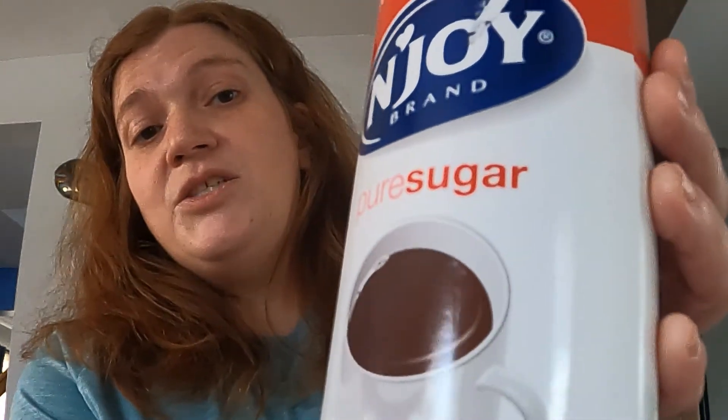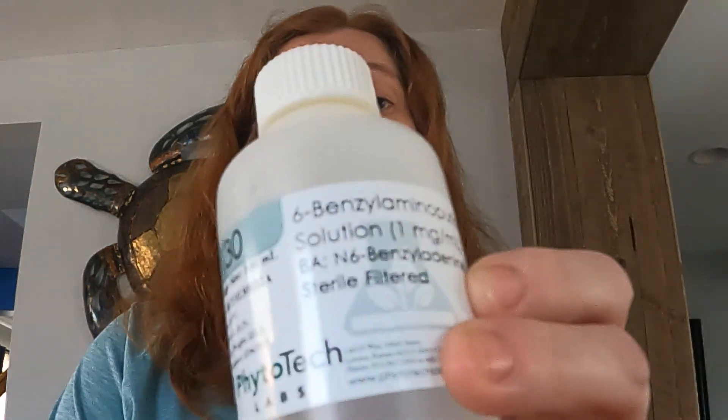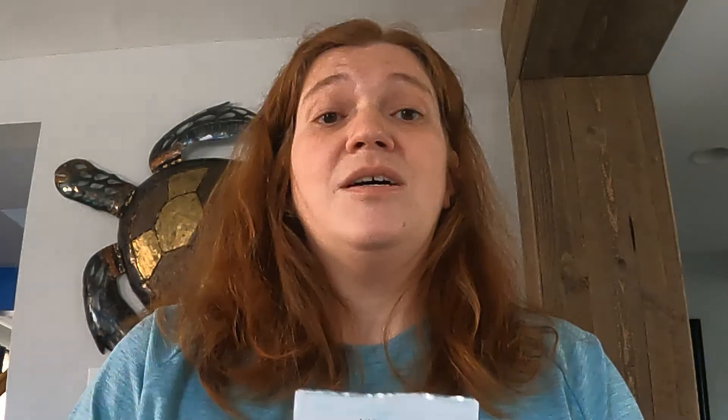The final items that you're going to need are the ingredients for your media, starting with sugar. Any sugar will do as long as it's pure sugar. You'll also need Murashige and Skoog media with vitamins. You will need two plant hormones for the medium that we're making. One is BA and the other is NAA. A gelling agent—I usually use agar, but it requires boiling. So for this demonstration, I'm going to be using Gelzan.